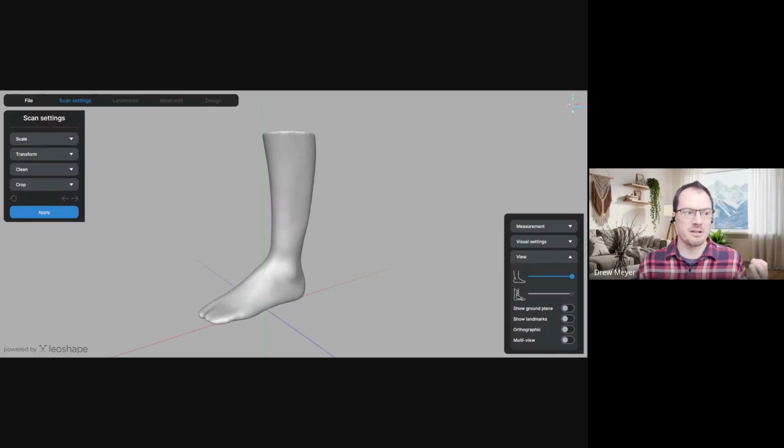We're trying to launch some new tools recently, and we've updated a lot of features to make things a little bit easier, faster, cleaner, and smoother as you're going through the design process. I'm really lucky in this position where I get to talk to people all over the world and learn how people are doing AFO fabrication in all sorts of different environments.